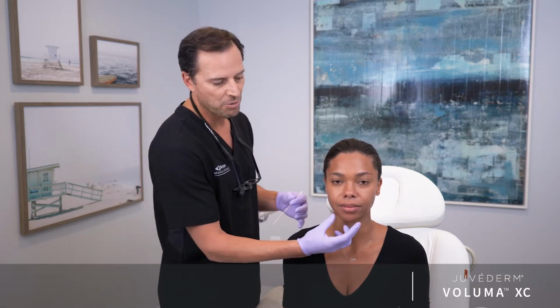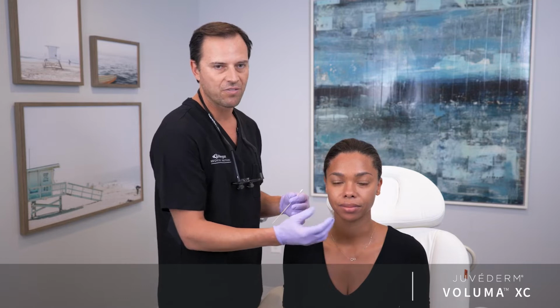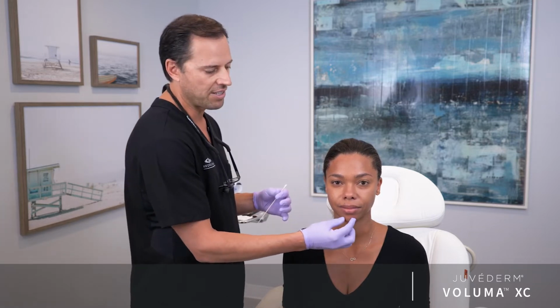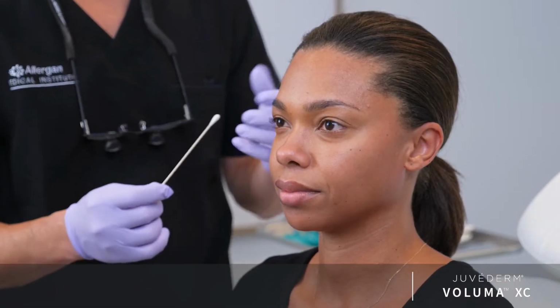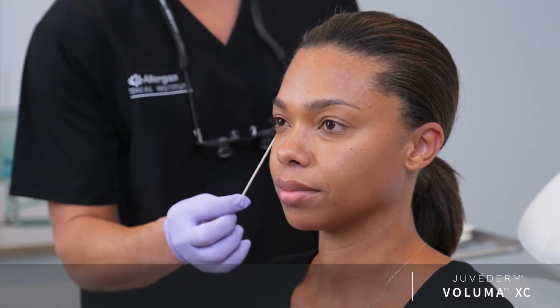Furthermore, she talked about facial shape and how she'd love to see a little bit more definition to the chin. She felt like she had a lack of definition to the chin, which impacted the appearance of her overall facial shape. So what we'll do now is an assessment of Talisha's cheeks.